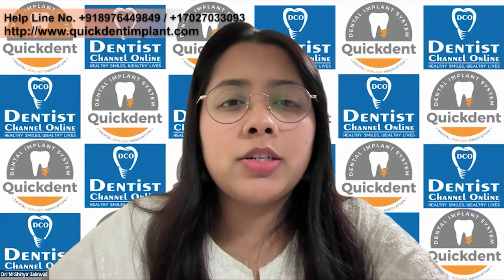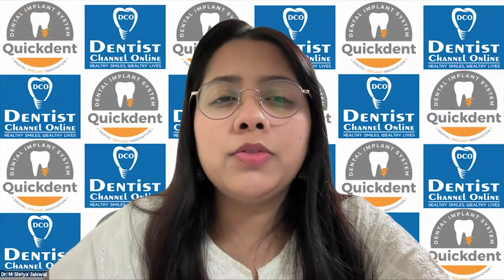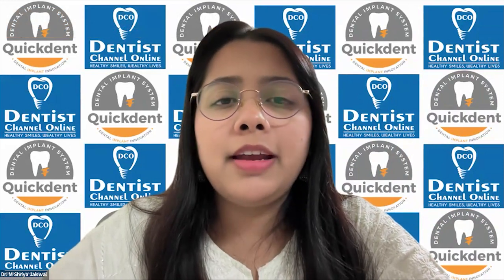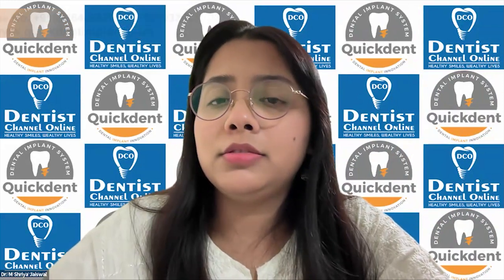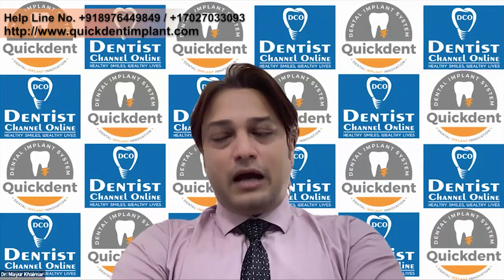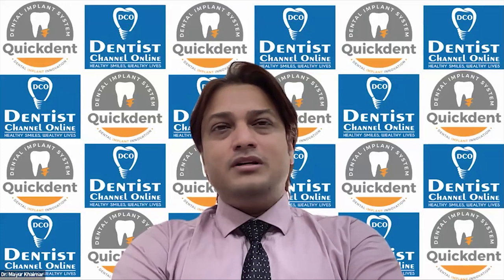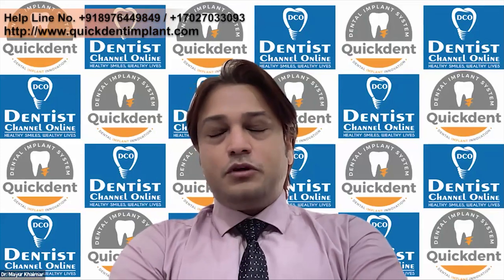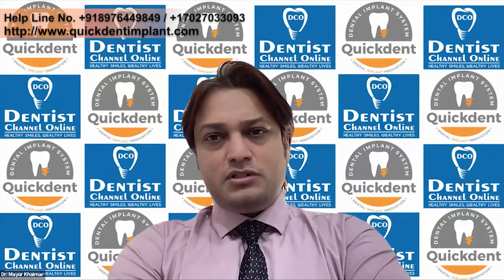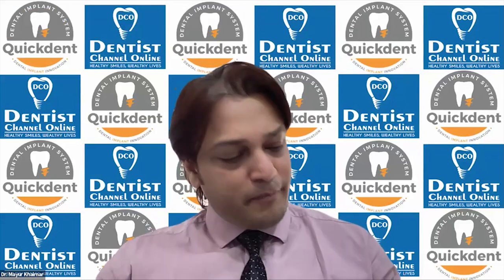Next question is from Dr. Nirali Agarwal. Good afternoon, sir. Which scanner do you use for this? And is there any stitching error? So for stitching errors, I use Prime Scan. It's not about the scanner, but more important is the technique. If you're doing post-surgery scanning, blood is there, so certainly some error may happen.